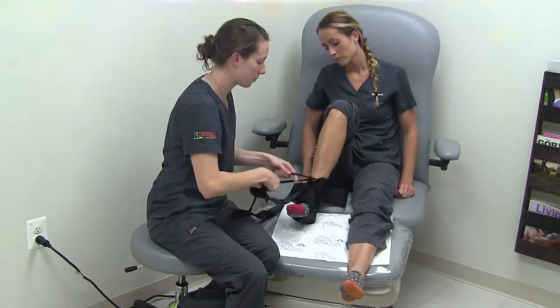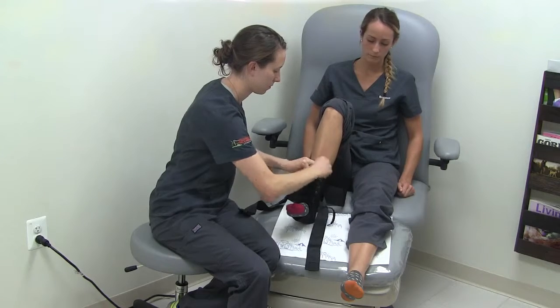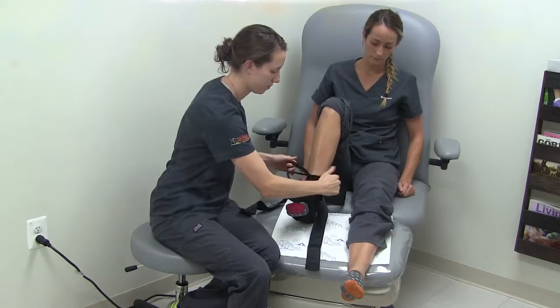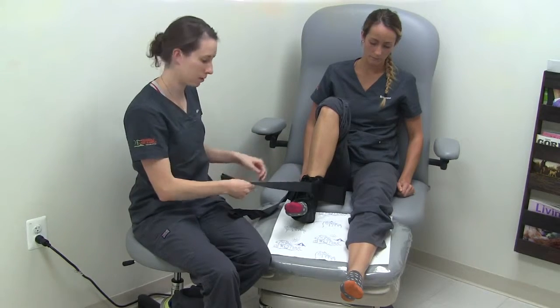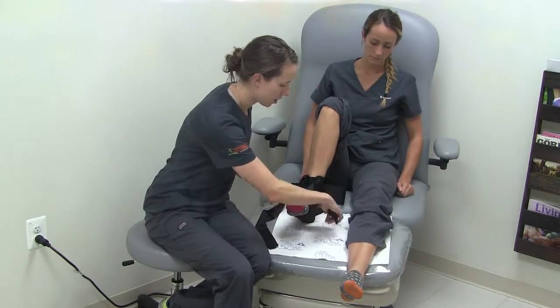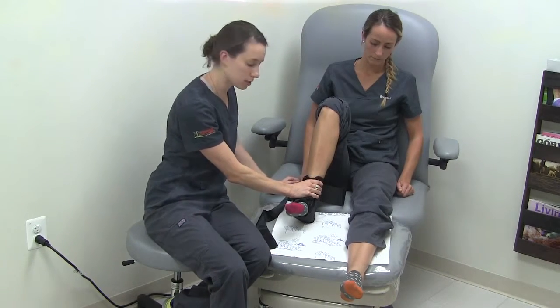Tying a bow at the top. Next, take one strap in front, up under the arch, and back up to the same side, all while keeping your ankle at 90 degrees.